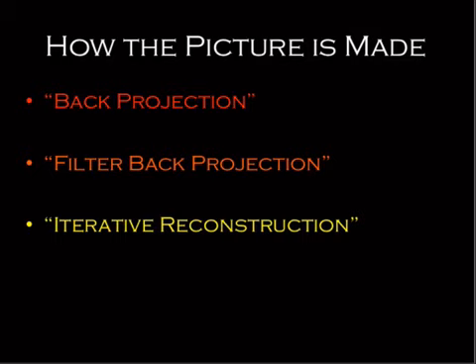Now, it's been around a long time, but it's only recently being employed because it requires so much computational power, and the older systems could do it, but they would just take forever. But now stuff is faster, so it's there. So it allows you to lower the dose and allegedly maintain imaging quality, even though I think these things look bad most of the time. But there's a natural trend and fear of radiation.